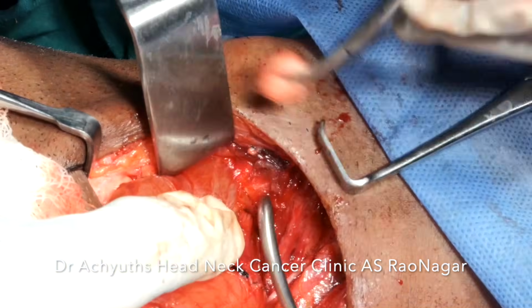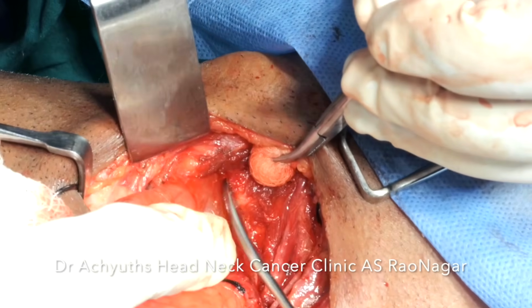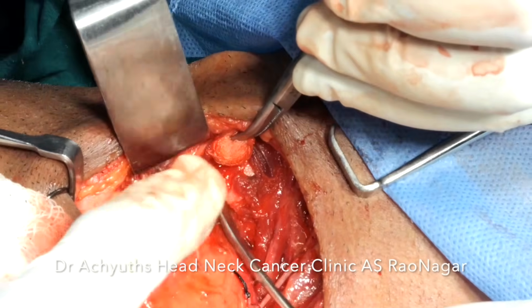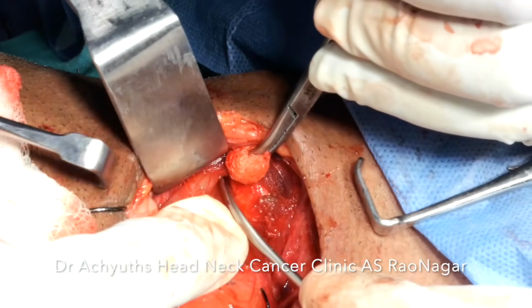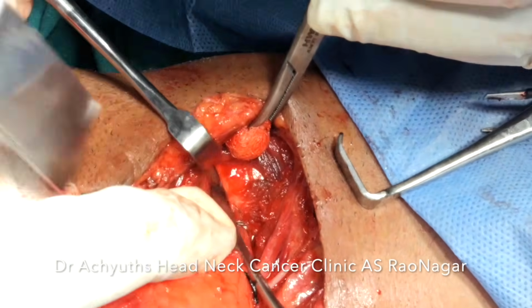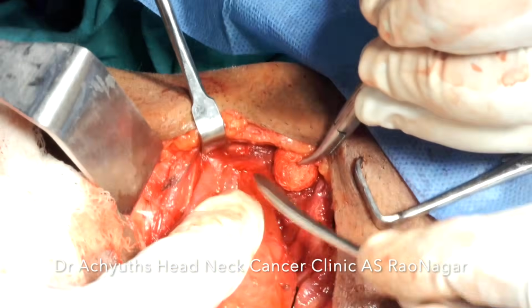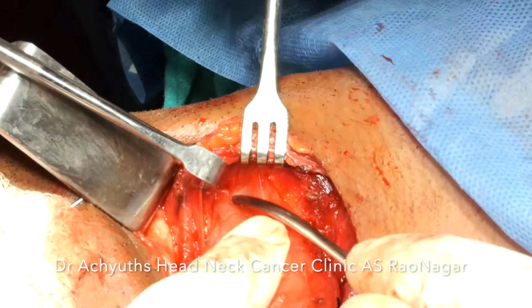Now we are dividing it from the, see, this is the thyroid cartilage, and we are dividing from the thyroid perichondrium now, the inner perichondrium of the thyroid membrane. So the perichondrium is being lifted with the tonsil elevator.